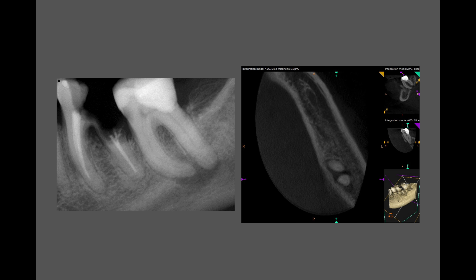Instrumentation is done using a Root ZX apex locator to get accurate measurement. Irrigation is done very carefully with side-vent syringes. The obturation technique I use on all cases now, especially this case, is the single cone calcium silicate technique. Key is getting the apex locator reading right and confirming it with a radiograph, because with an open apex you'll have difficulties with the apex locator reading. Also, with irrigation, make sure the needle is never engaged and blocked — and the same with cement placement.